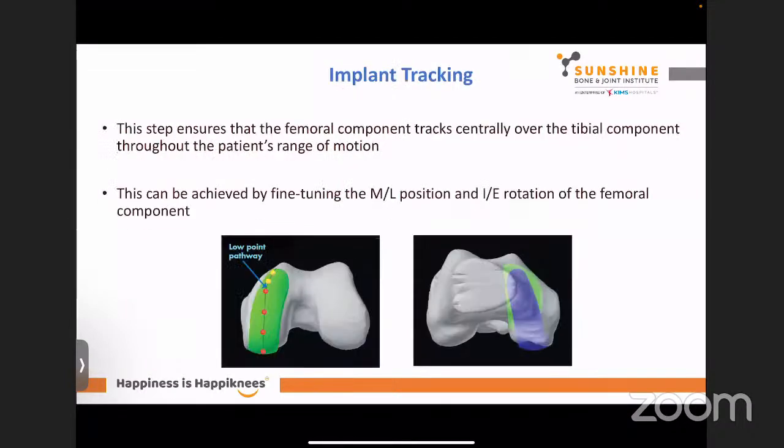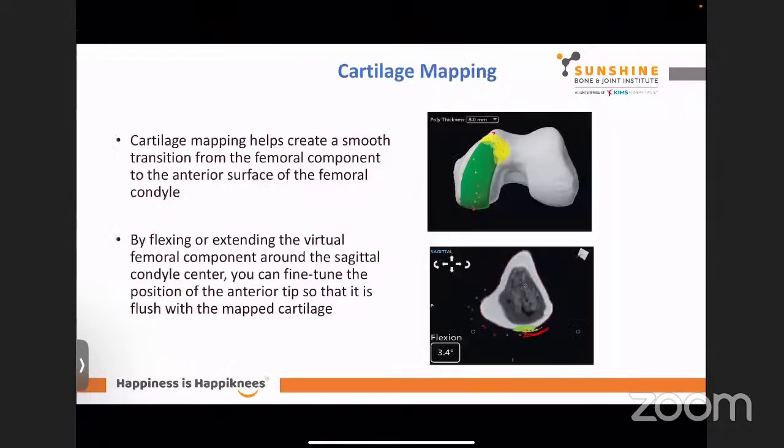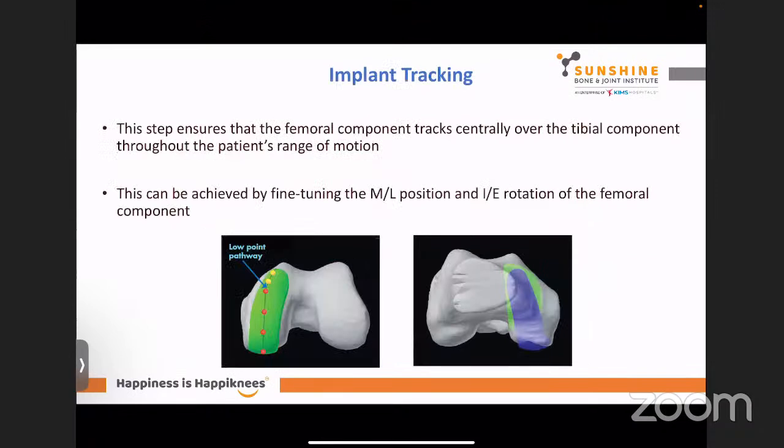Then I mentioned implant tracking already. Didn't I? No, I didn't mention implant tracking. So here, this step ensures no edge loading. Because in a mobile bearing uni, the poly moves along the implant through flexion and extension, so you don't have an issue of edge loading. But here, because it's a fixed bearing implant, you can have an issue of edge loading if you don't have your centrally tracking implants.